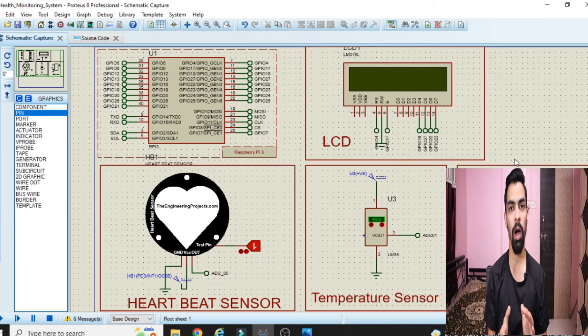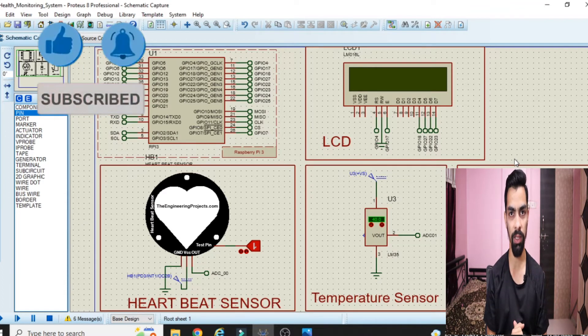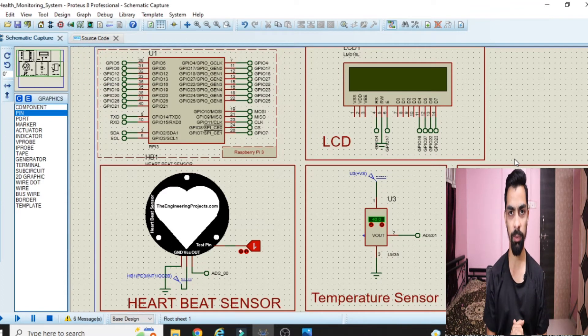Hello friend. In today's video we will learn how we can design and simulate a health monitoring system project using Raspberry Pi hardware. To measure the heartbeat we have the heartbeat sensor, and to measure the temperature we have the LM35 temperature sensor. We will learn complete hardware connection, how to design this project in Proteus software, the program behind this project, and how to run it.